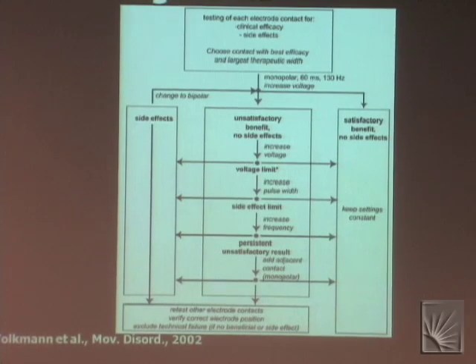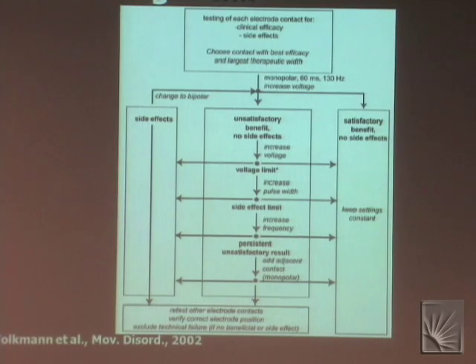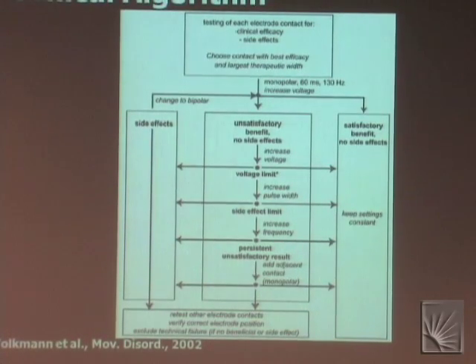But what we don't know is what contact and what is the exact stimulus titration that should be used. Unfortunately, there's very little in terms of visual guidance to help the clinician select these stimulation parameter settings. If you actually calculate this out, of realistic stimulation parameter settings, there are well over 1,000 settings that could realistically provide therapeutic benefit in any given patient.